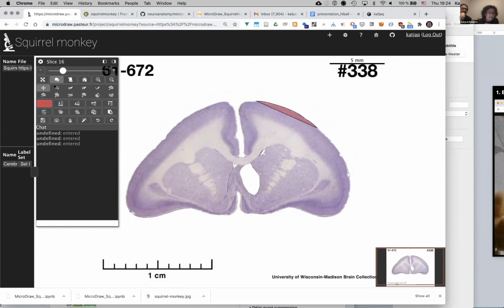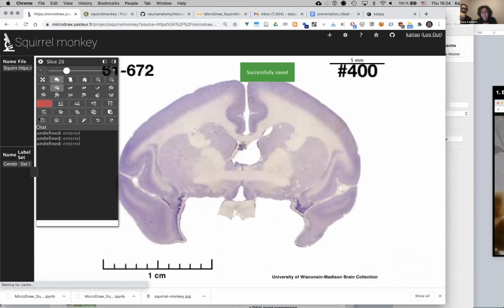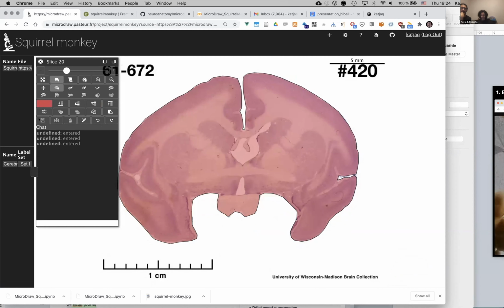There was a little error. I'm just gonna delete this. And save. And then we're gonna go to the notebook and download the data and do some analysis.